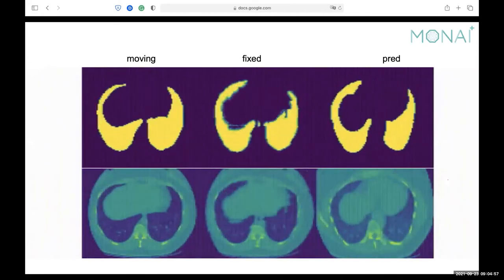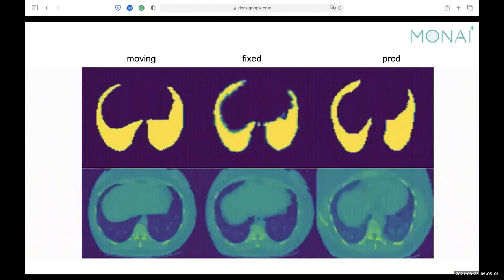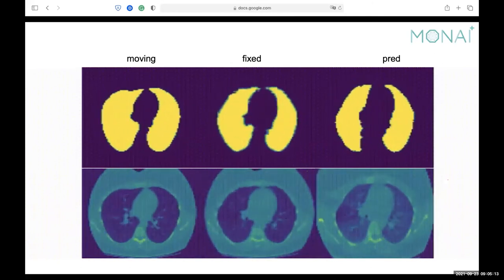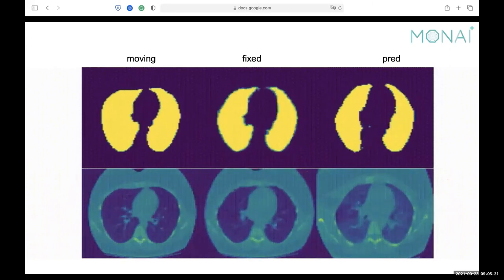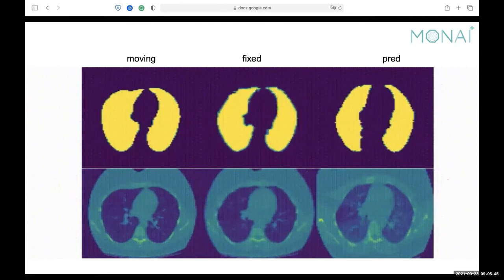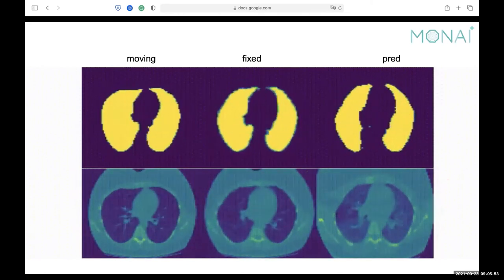As a result, we can see the results after the full training process. The prediction is much more similar to the fixed image than the moving image. Due to time limits, we suggest users run only five epochs with the provided Jupyter notebook to see the loss going down. The full process takes about one to two days. We have uploaded pretrained results to Google Drive, so pretrained checkpoints can be downloaded and used for validation and visualization of the final output.